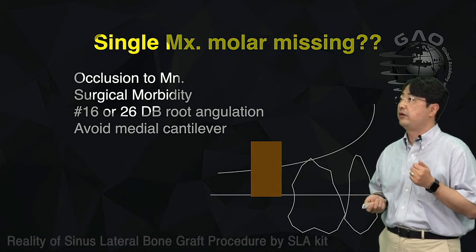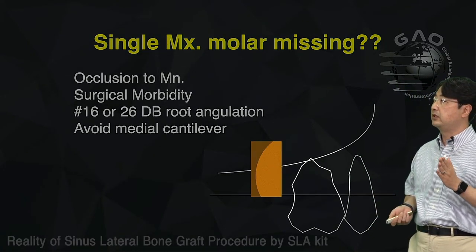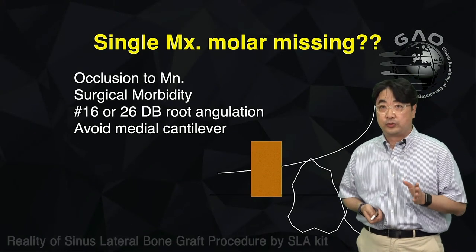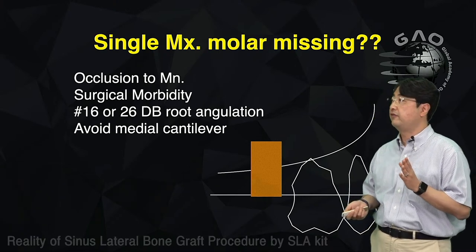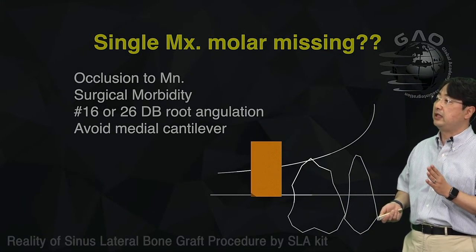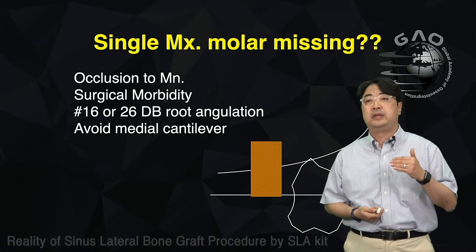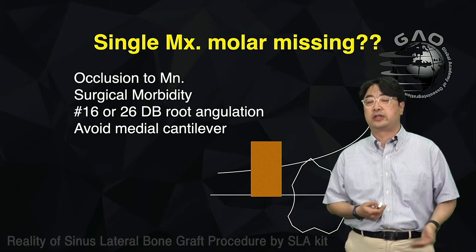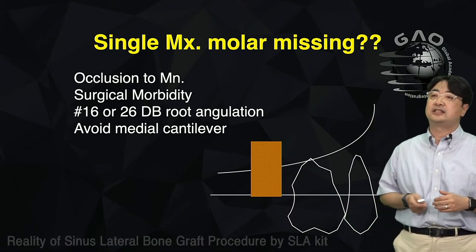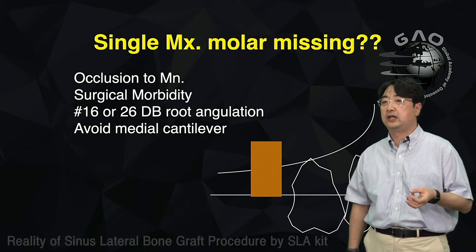So you have to check the occlusion, right? And also you have to think about the distal buccal root angulation as well. If the distal buccal root is too distal, then you may need to place the implant distally, then it creates the medial cantilever as well. That's not good from the mechanical point of view, right? So in those cases, I don't usually replace the last molar with an implant.